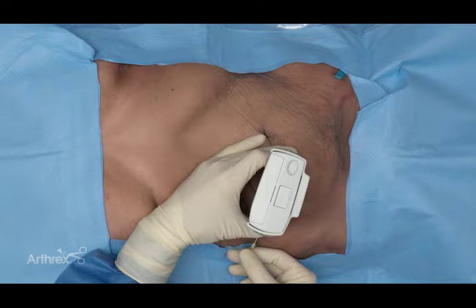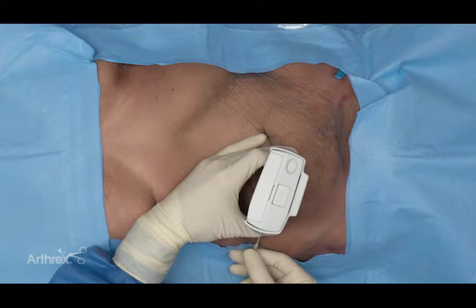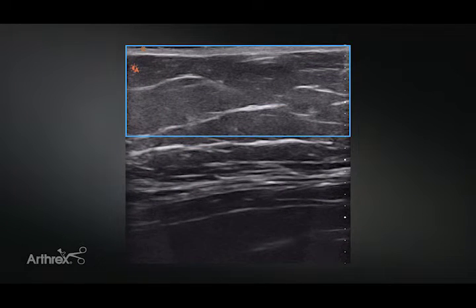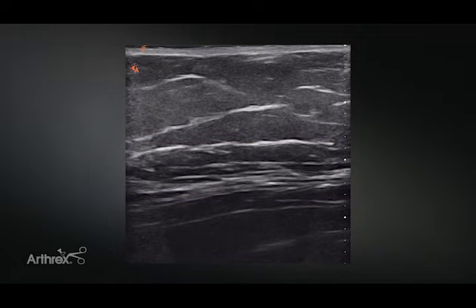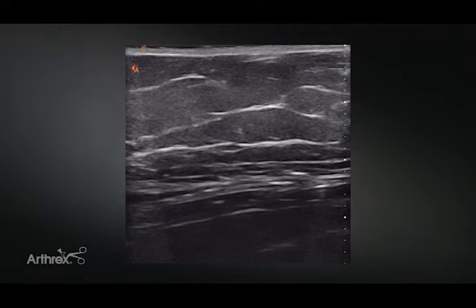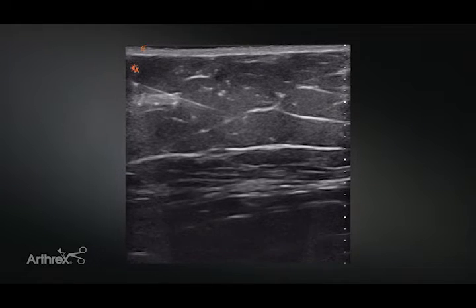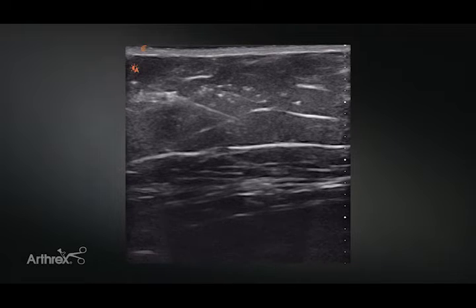We're ready for our local anesthetic phase — not the full tumescent phase, just 10 cc's of 1% lidocaine with epinephrine to get the patient comfortable. This is also a good step for judging needle placement and depth. On screen, we have the abdomen layer: adipose on top, abdominal musculature at the bottom. We introduce the needle carefully, staying in the adipose layer and not going at too steep an angle to contact the abdominal musculature. Under ultrasound, the needle is clearly in the adipose layer, not in danger of hitting the abdominal wall, and we start administering our lidocaine.